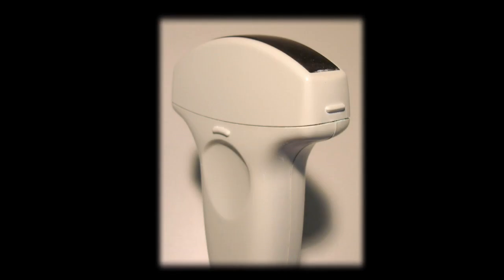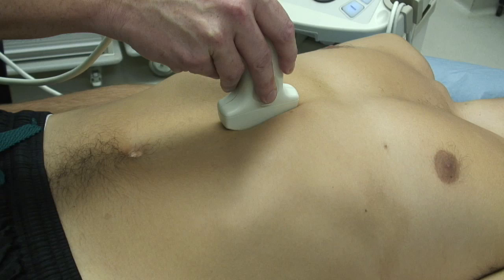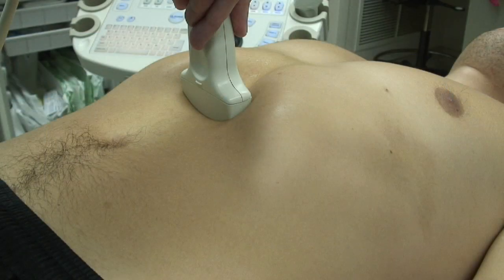To perform the exam, a curvilinear abdominal transducer is used. To begin, place the probe just below the xiphoid and obtain a longitudinal view in the standard manner with the marker dot toward the patient's head. Alternatively, a transverse view could be obtained in the same position with the marker dot pointing to the patient's right. Using gentle pressure will help displace more superficial structures.